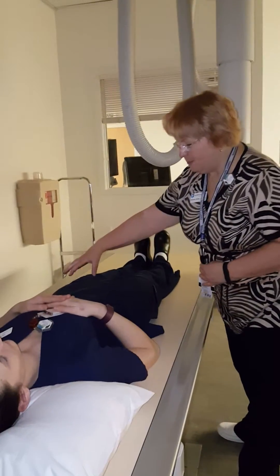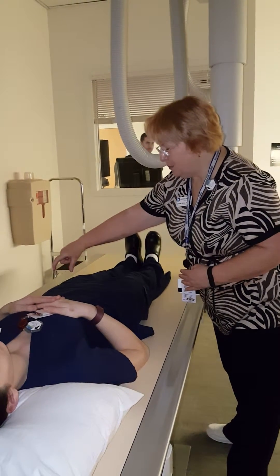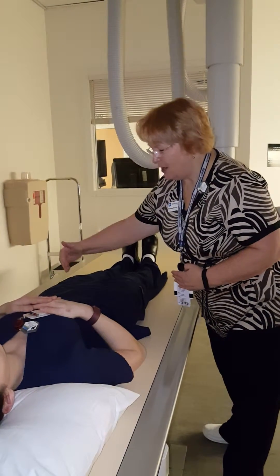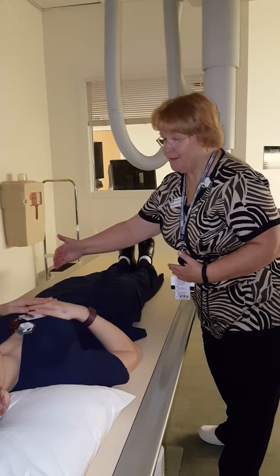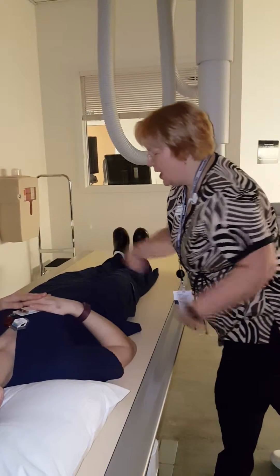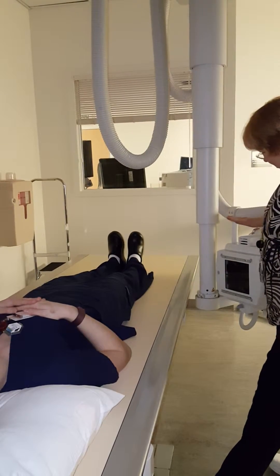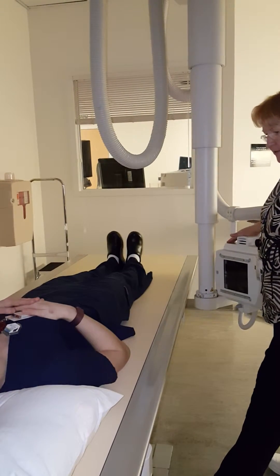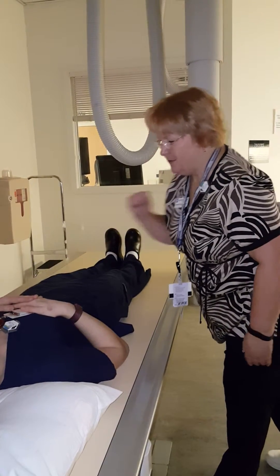If the left hip is the hip of interest, the femoral neck comes out of the body anywhere between 50 and 40 degrees. Halfway between 50 and 40 is 45. So we want the central ray to be perpendicular to the long axis of the neck. So if I am angling my tube at 45 degrees, I will be perpendicular to the long axis of the femoral neck.